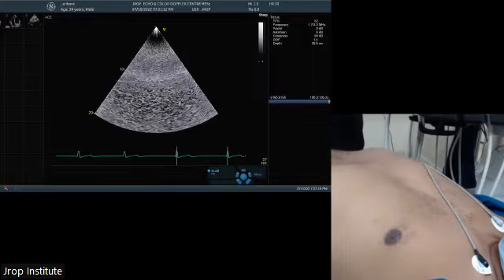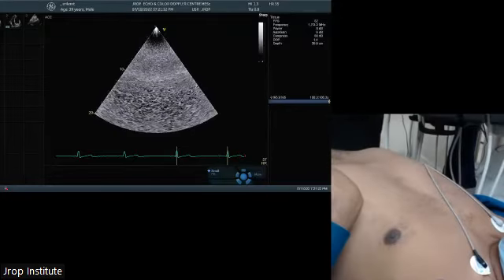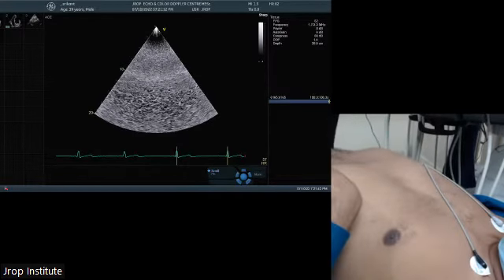When pericardial effusion is generalized, we always measure in the subcostal window. When it's localized, then we measure from different windows, to show that this pericardial effusion was present over there. Then they tell you anterior, posterior, inferior. So many classifications come up automatically. Okay, thank you, sir.